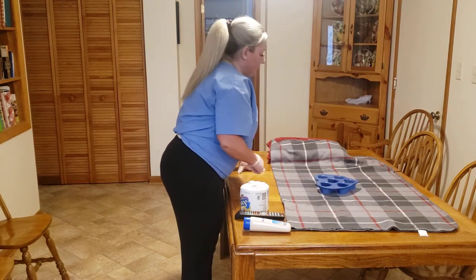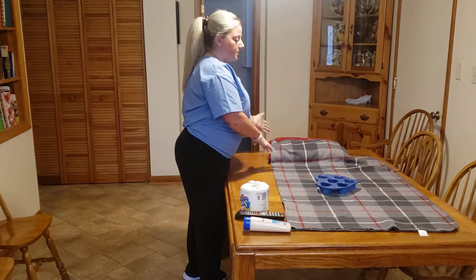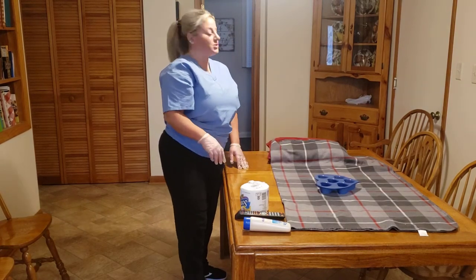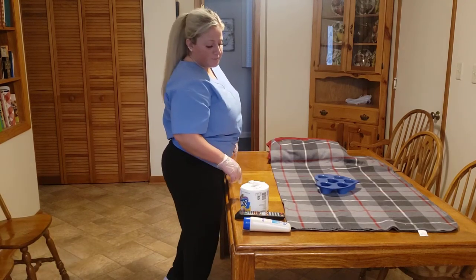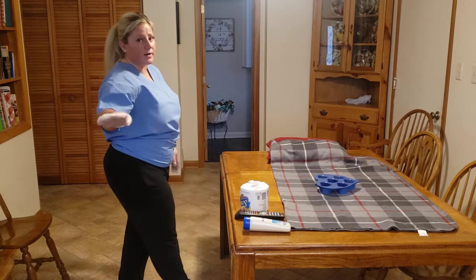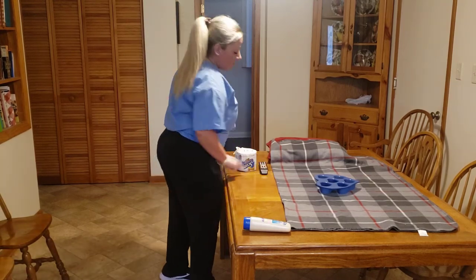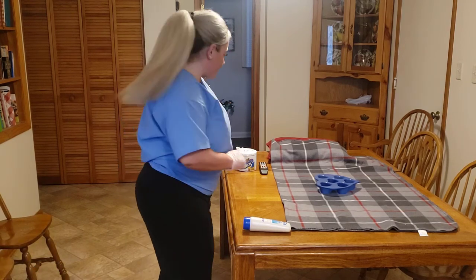You can go ahead and sit back down. From that point, you are going to raise the patient to close to a semi-sitting position — not a high Fowler's position, but you want to have them sitting up. Then I'll lower the bed back down to the floor because we are going to give them their privacy. Give them their toilet paper and their call light. Use your call light when you are ready to be taken off the pan.